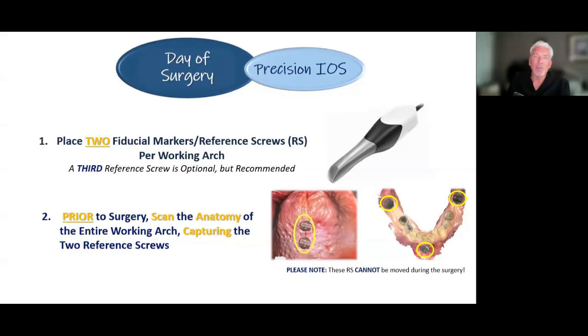It doesn't take very long to put these in at all. They're easy to remove as well, but they're placed prior to the surgery, and then you scan. That's your first scan the day of surgery, with these markers in place.